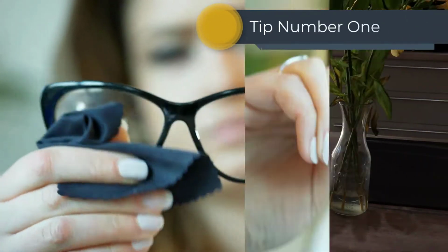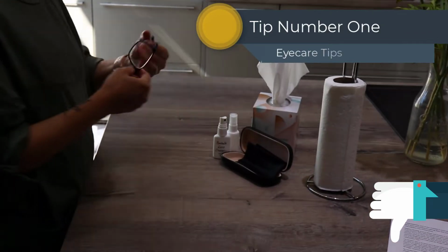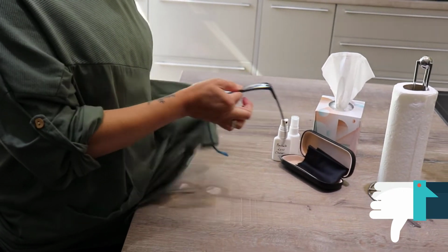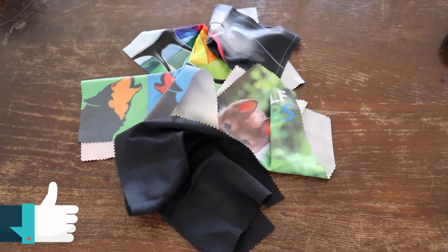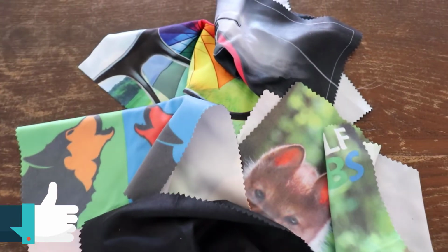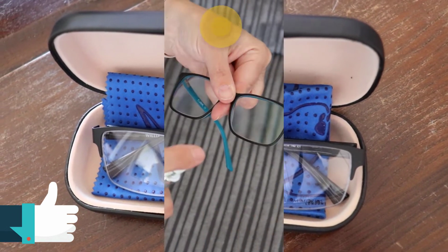Tip number 1 is to never use paper towels, tissues or clothing to clean your lenses, as these all have textured surfaces which can easily scratch your lenses. Always use a microfiber cloth which is specially designed to pick up and remove dirt and grease from your lenses. You'll find a brand new one in your spectacles case, and we always have some on hand in our practice if you need a replacement one.